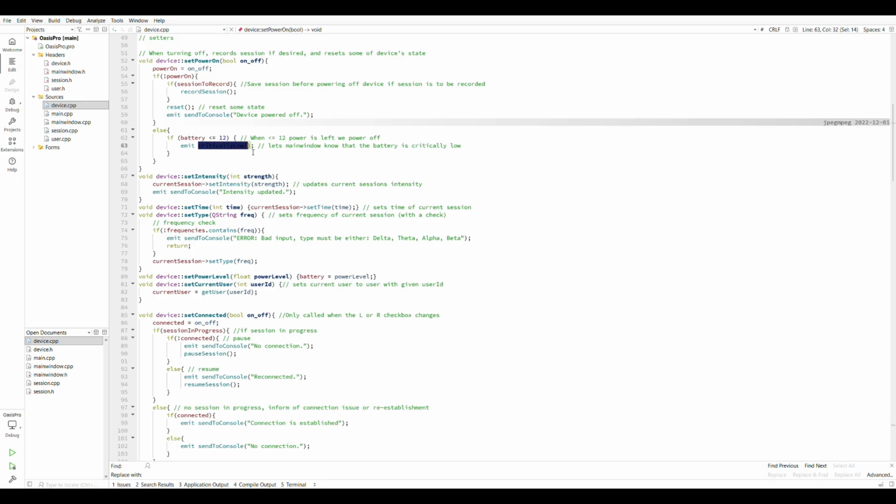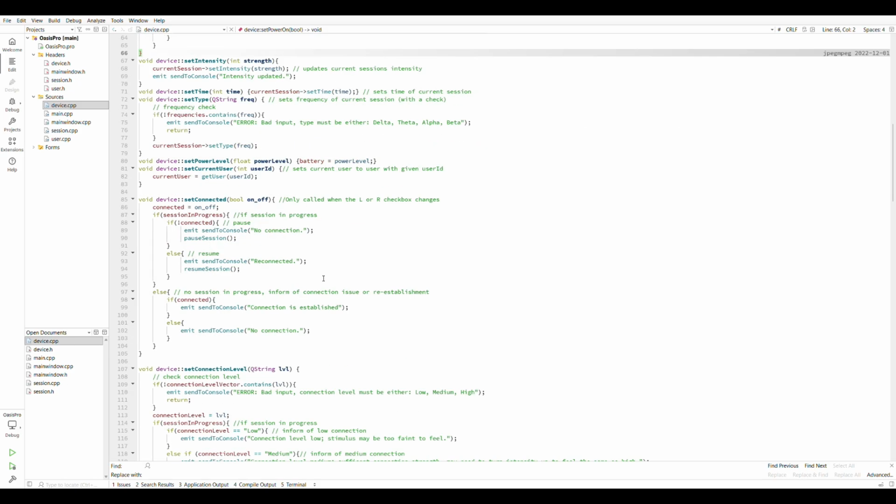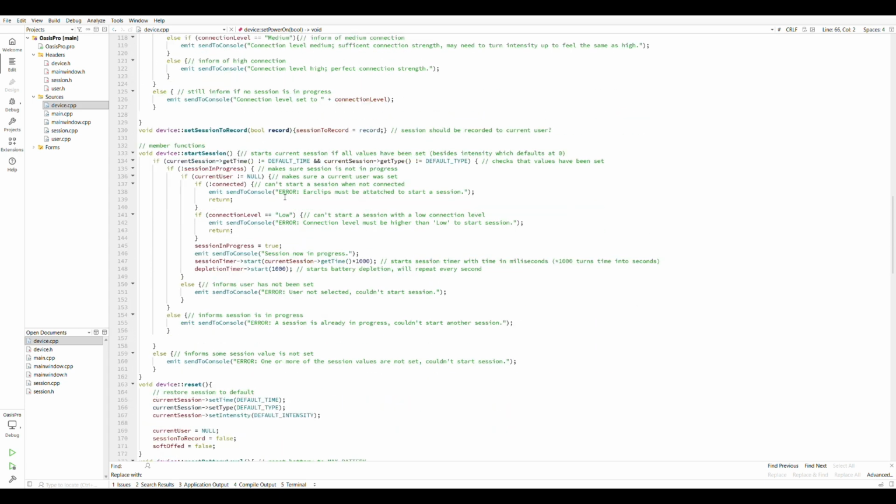It also can emit a critically low signal, which I didn't show off, but you can test it yourself. Once the battery gets low enough, it'll go critically low and let you know, and eventually it'll turn off and stop working. There's a bunch of other functions in here. This is a big one, the start session.